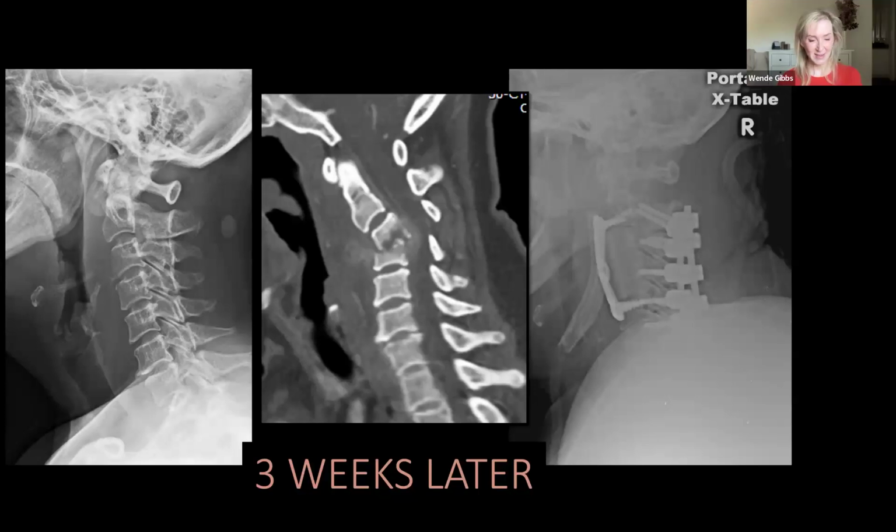What do you think of my intravenous contrast thing in the middle there? Do you like it? I love it. I think it's great. I've actually seen that before on CTAs, where if a patient comes in and they have a CTA, you'll be able to pick up on the fact that they have an abscess.